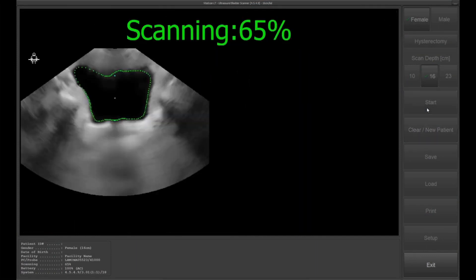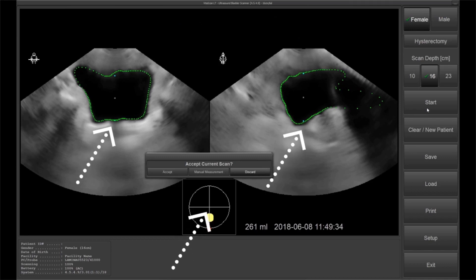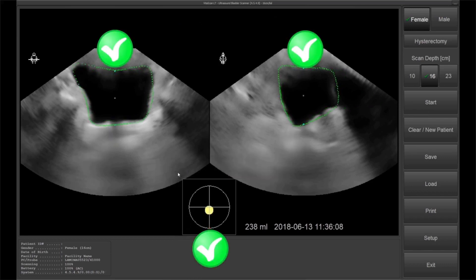Keep the probe in the same position until the progress bar shows 100% and 2 images of the bladder are displayed. The probe will take 6 to 24 images of the bladder in different cross-sections to build up a 3D model, and based on this model, the software will calculate the bladder volume result. Evaluate the scan before accepting the result.